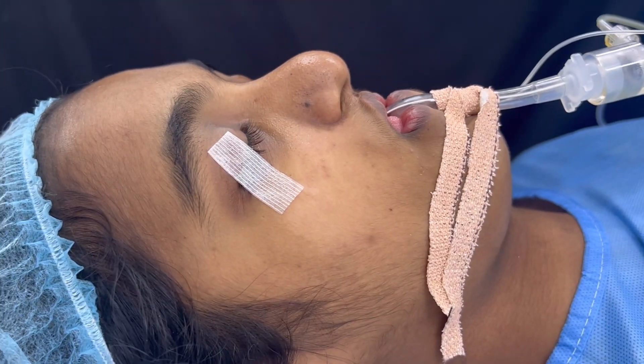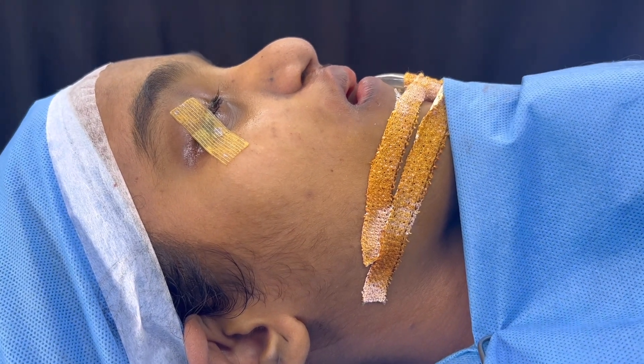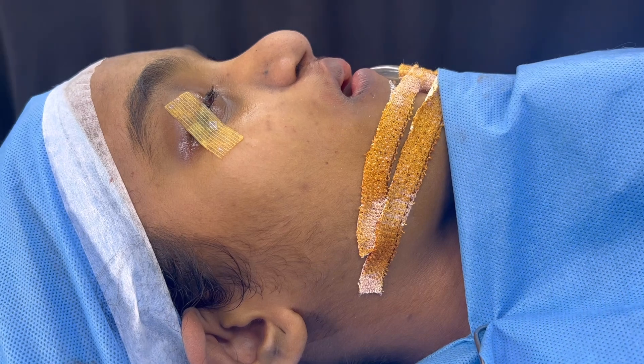This is her before we start the surgery. We have finished with this underbite correction — upper jaw advancement by means of distraction osteogenesis.